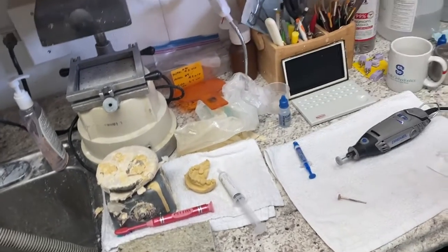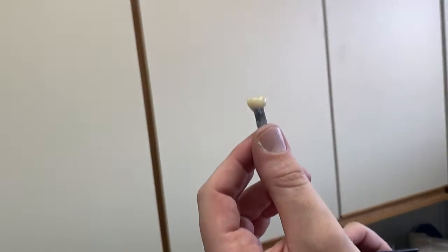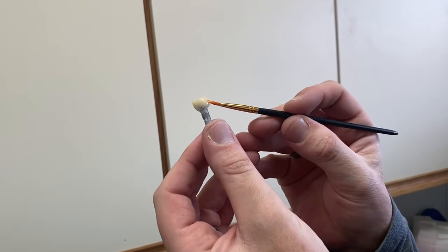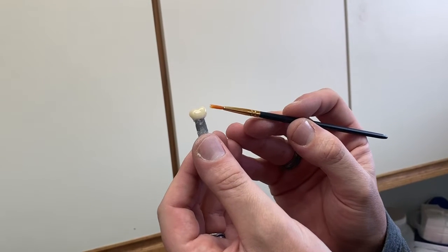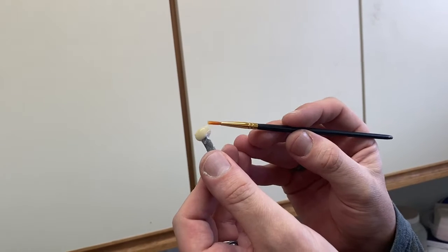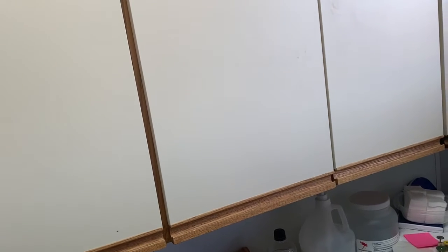The last thing you want to do before you set it in the oven, once you've got it all the way glazed, hold it up to the light and look at the reflection all the way around. If you see a little bubble somewhere, or if you see a little protrusion, it means you've either missed a spot, included an air bubble in your glaze, or you've picked up a small piece of that super peg putty.